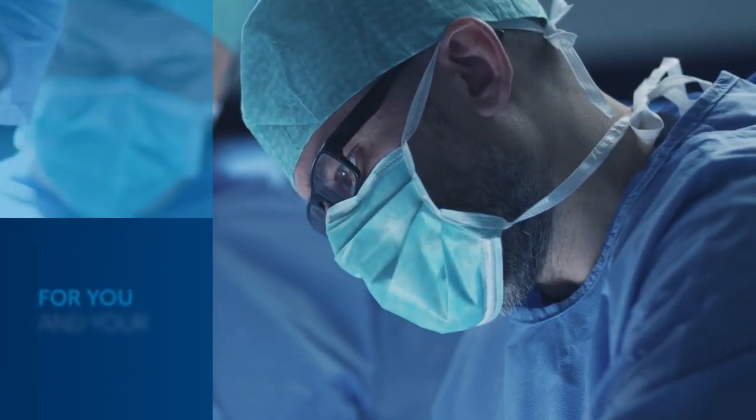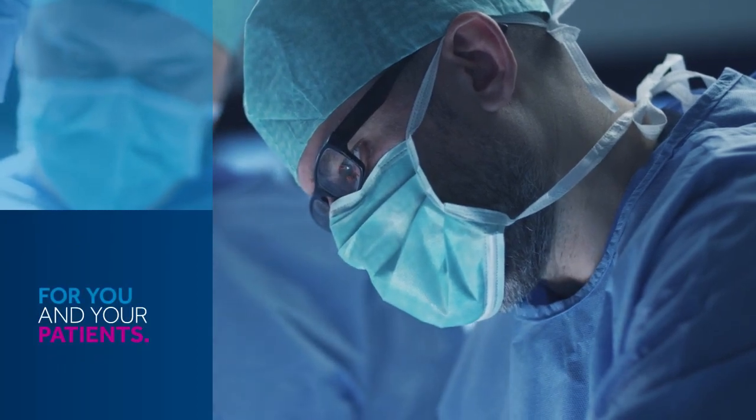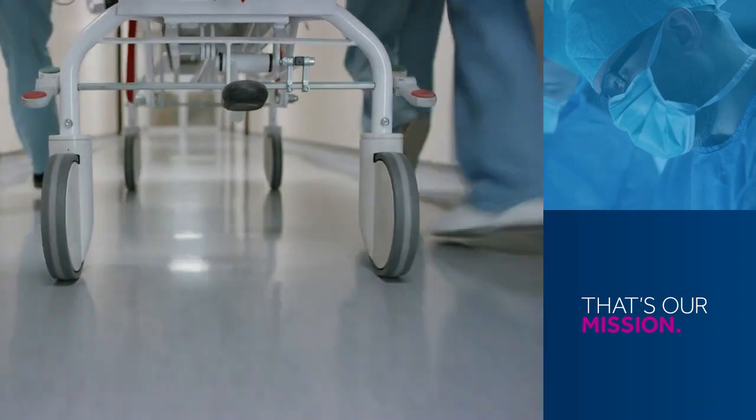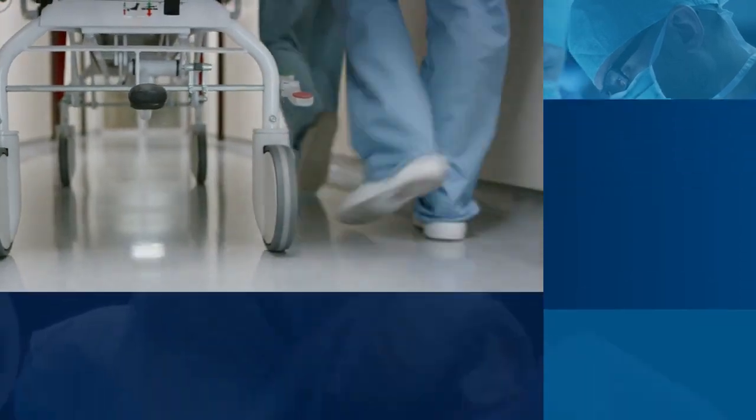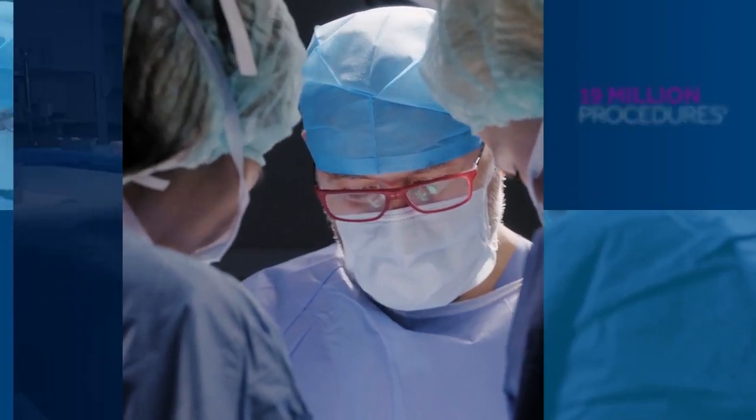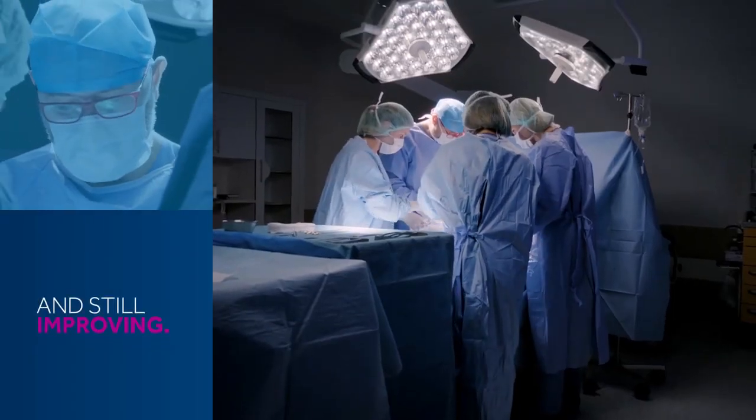Innovation for you and for your patients. That's been ValleyLab Energy's mission since 1967. Our ligature technology has been used in over 19 million procedures and we continue to improve on our products.